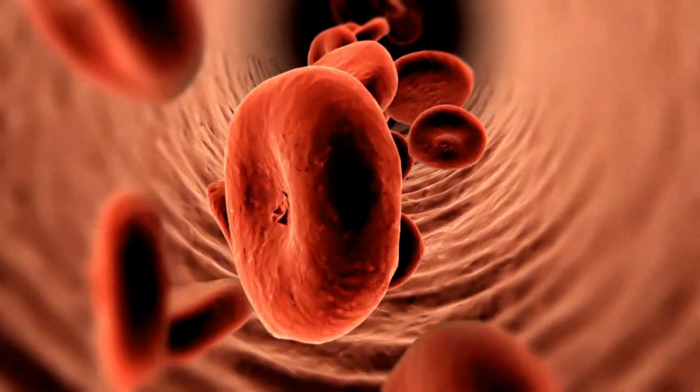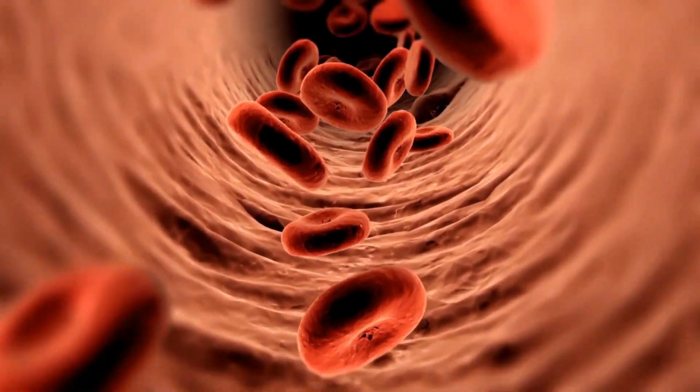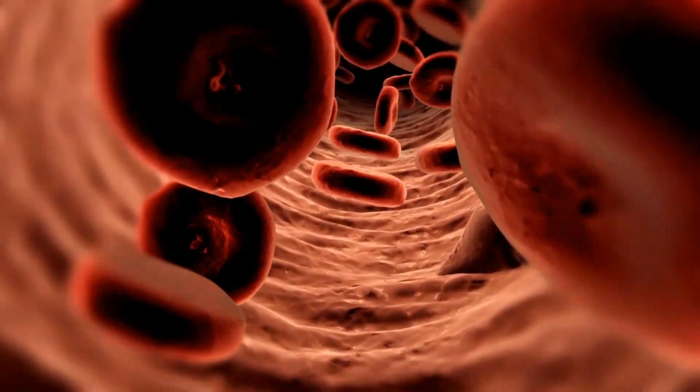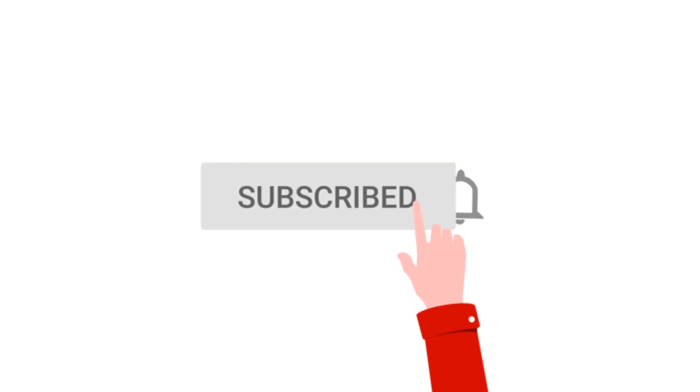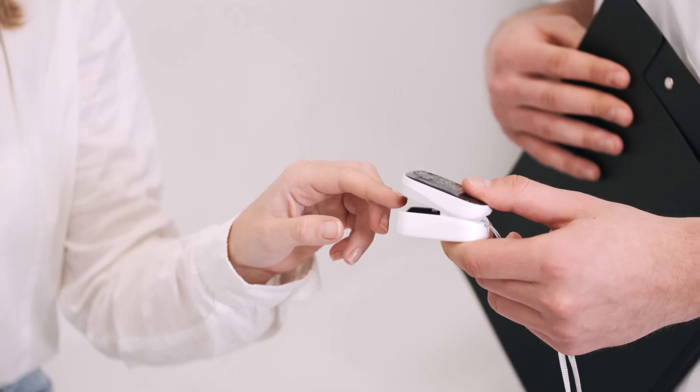It displays the percentage of blood that is loaded with oxygen. More specifically, it measures what percentage of hemoglobin — the protein in blood that carries oxygen — is loaded.